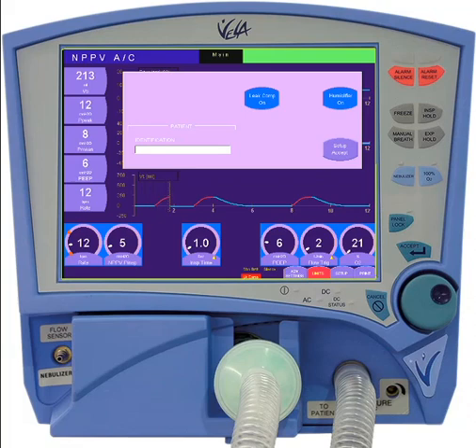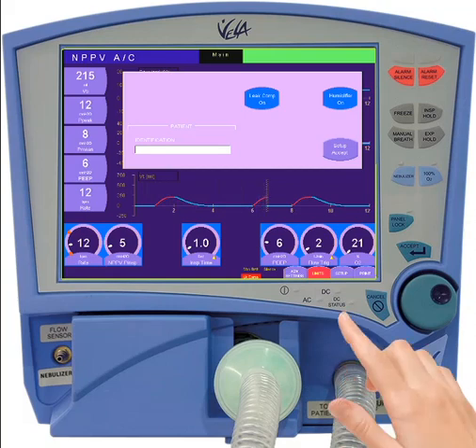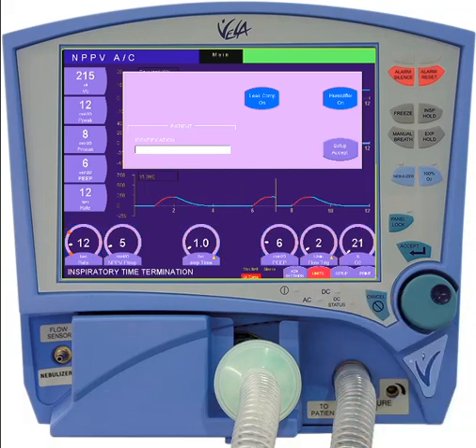Also on the setup menu is the humidification button. When using passive humidifiers, this should be turned off.